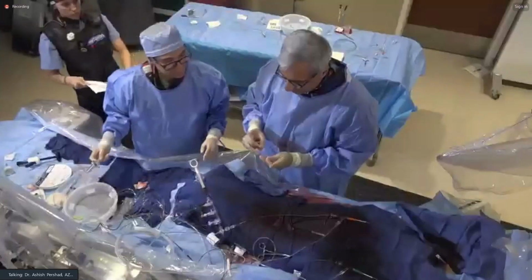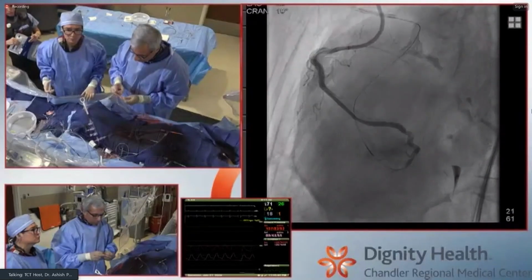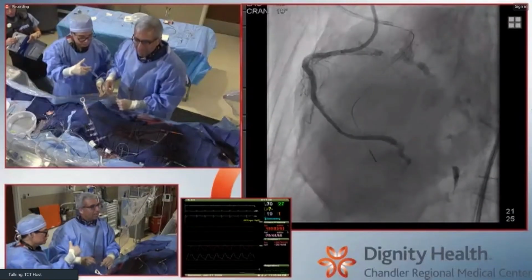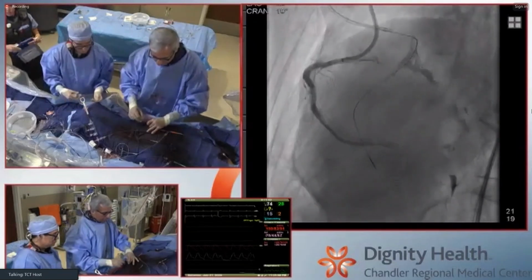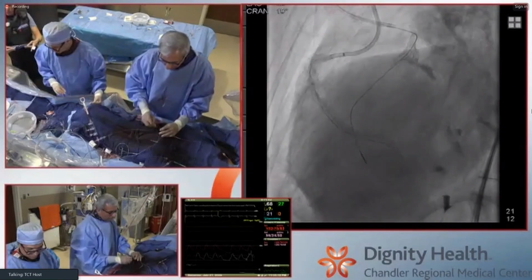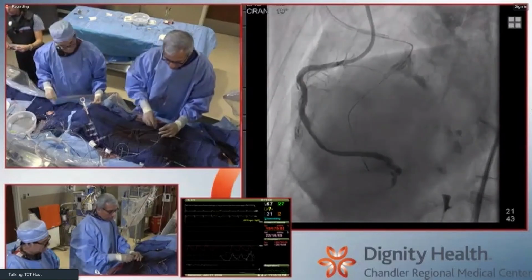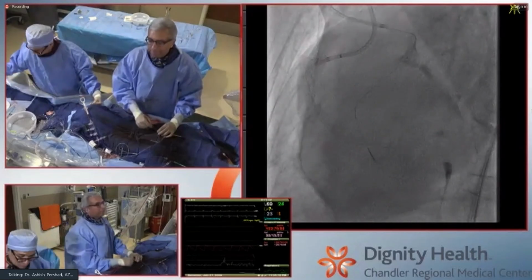What do you guys think of the segment in the mid right that we discussed? This view looks worse, but the other view looks better. Doesn't look bad, I hope, because of the stent was very oval shape. It's not like round shape. That's a typical picture. Got it. Okay.